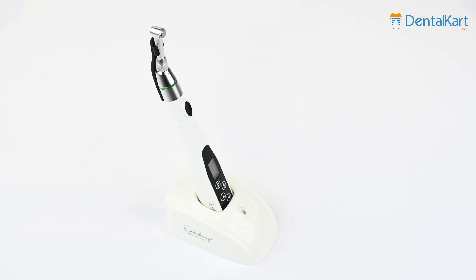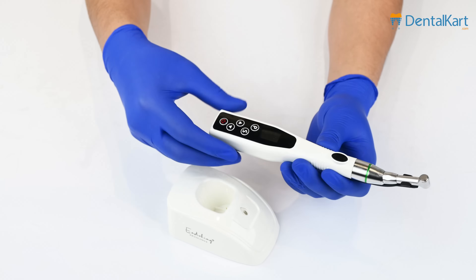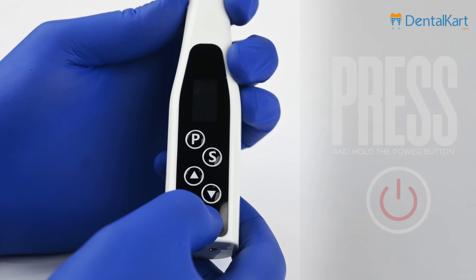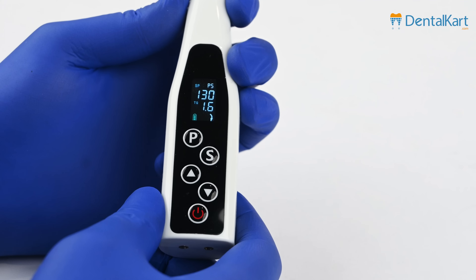Before powering on the device, make sure that it is fully charged. Once confirmed, press and hold the power button for a few seconds until the LED display lights on, indicating that the device is powered on. You may also hear a beep sound as confirmation.